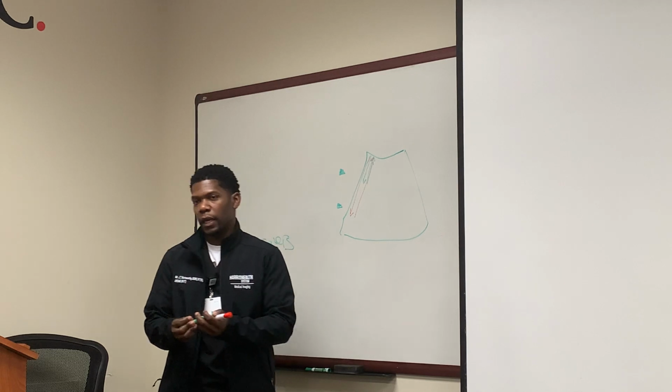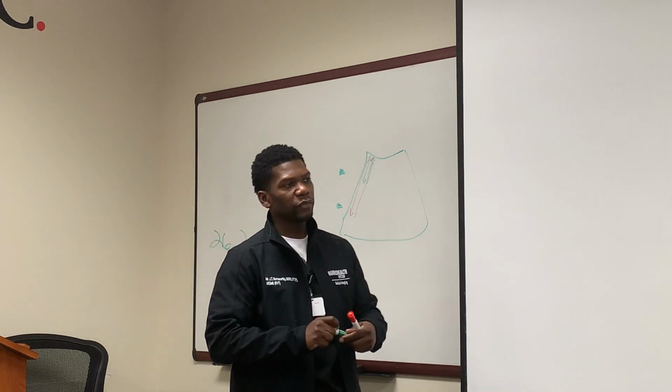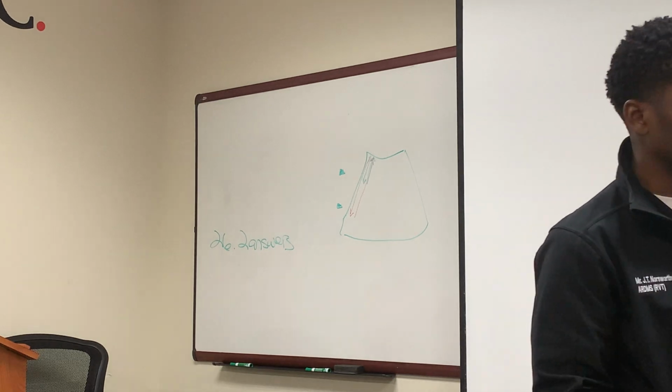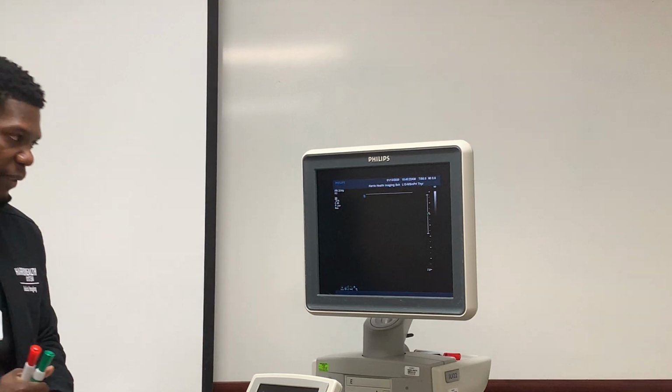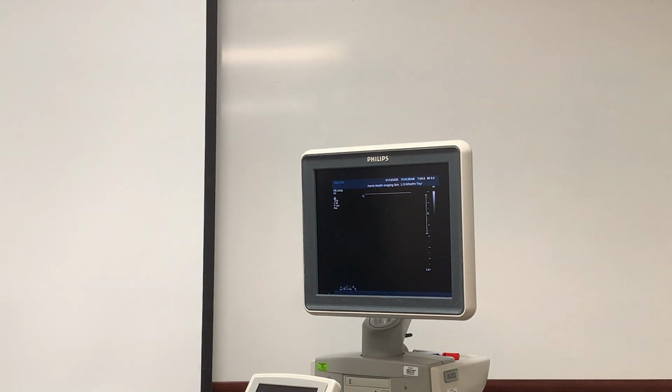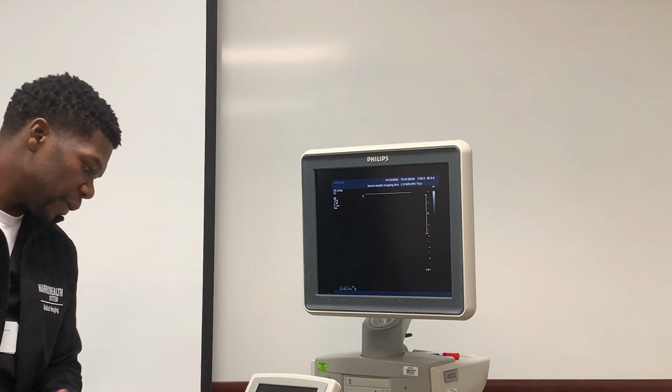Okay? And like I said, this machine right here, I don't think I have multifocus on here. I think that's the whole purpose of having the large focal zone. But we do have, we can adjust our sector width, right guys?